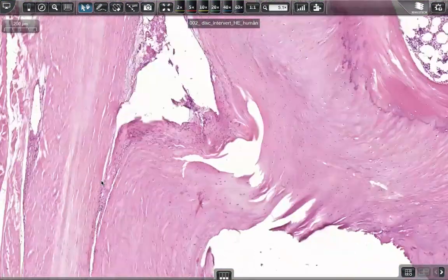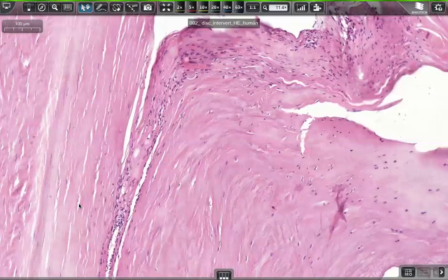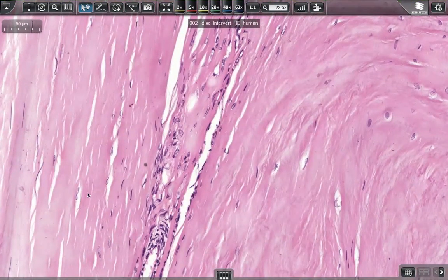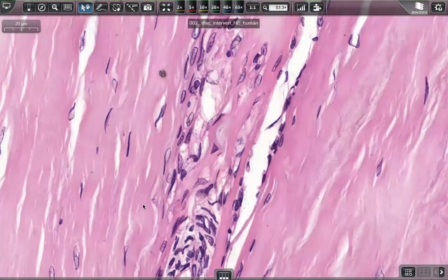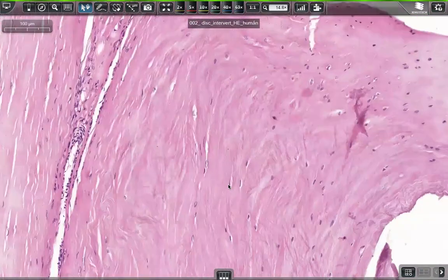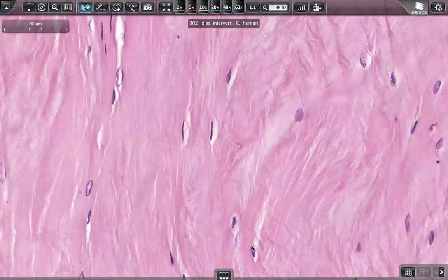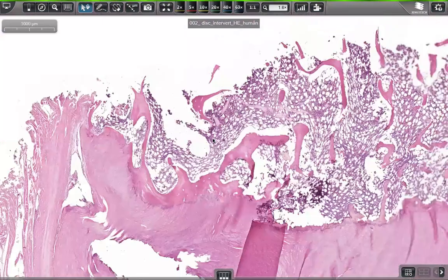and close to the fibrocartilage here, when we can see the connective tissue surrounding the intervertebral disc, we can see real connective tissue here. So here we have the fibrocytes, the typical appearance of the fibrocytes. These are coarse collagen bundles. So this is a typical fibrous structure having fibrocytes. They produce the collagen fibers. So this is a connective tissue, but this area here, these are chondrocytes in the fibrocartilage.